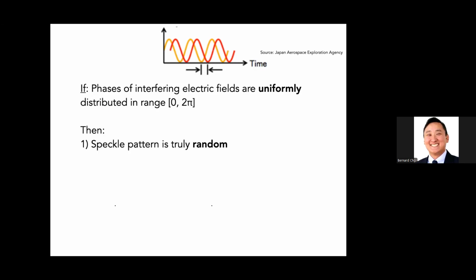then one of the things you're going to infer from it is that the speckle pattern is a truly random pattern. So speckle is a technology based in statistical optics. That's why of the comment that Bruce Stromberg made about this being the most complicated technology. It's statistical, in reality. At least at the level that we can infer things, it's not deterministic. If you go down to maybe the nanometer level, and you can freeze things in time, you can maybe get a deterministic piece of information from it. But for our purposes, things are happening in such a way that we can't measure at that level.